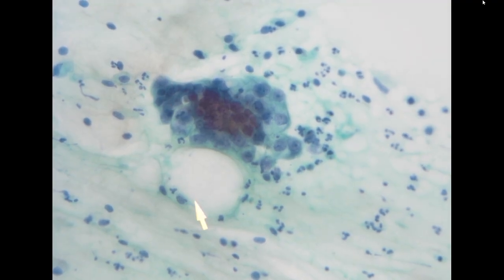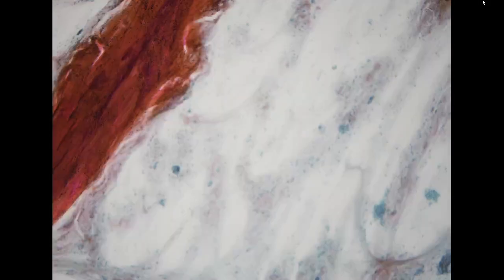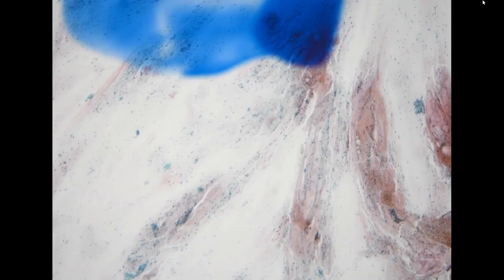And the patient already received curettage, and the curettage showed a grade 2 endometrial adenocarcinoma. And in the cervical smear, we see atypical glandular cells likely coming from the endometrium because of all the debris in the background. So it is compatible with abnormal shedding of the endometrium, and likely some of these glandular cells are coming from the adenocarcinoma. But with marked degeneration, we cannot make a definite call.